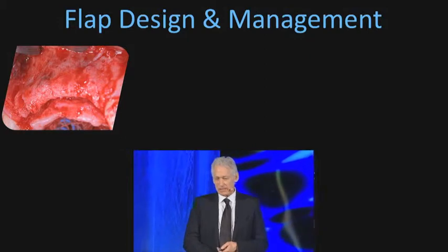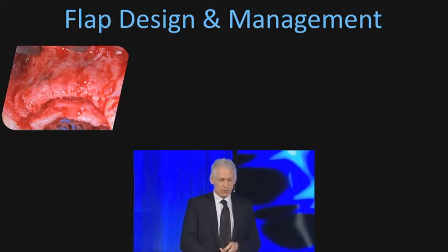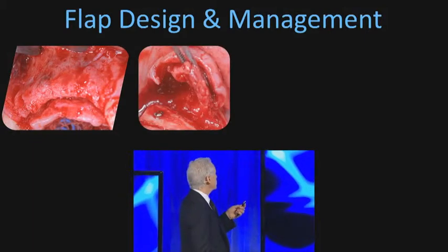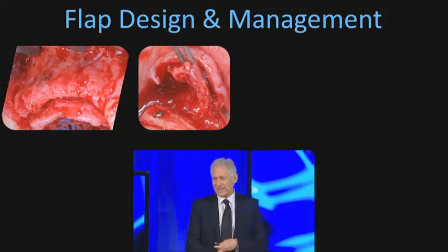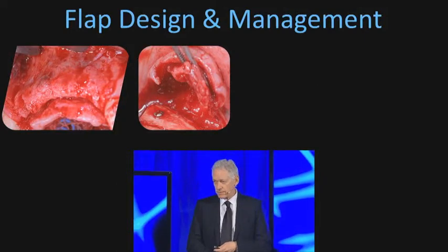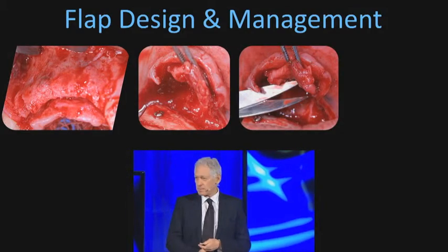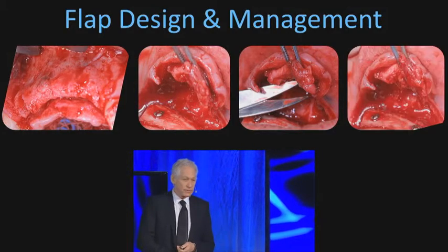First, I built up the tissue with a connective tissue graft. The flap is exposed, the area is exposed, and the internal part of the flap that is not thickened is dissected. So we have basically a double pedicle flap. Keep on dissecting it. The internal part of the flap will maintain its thickness. The outside will maintain the closure.